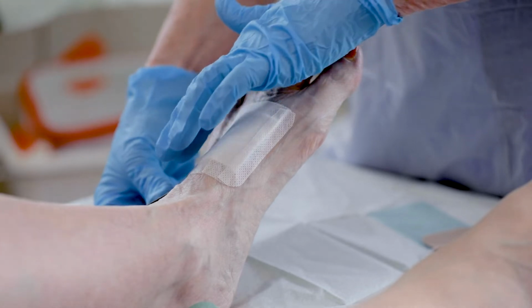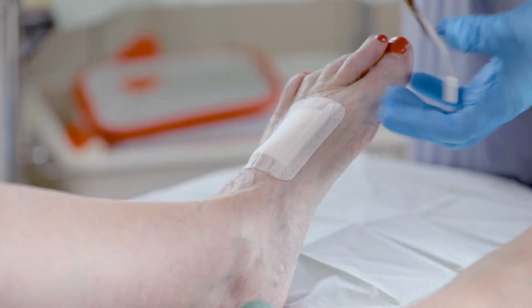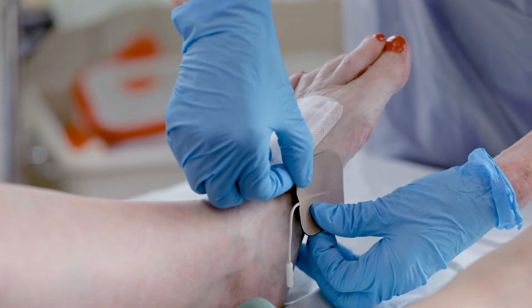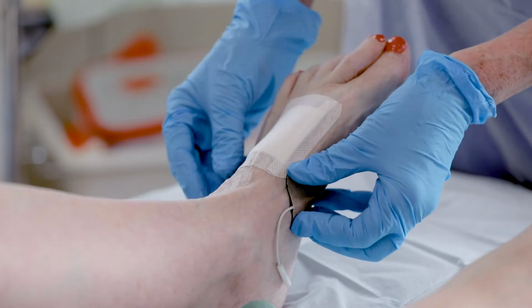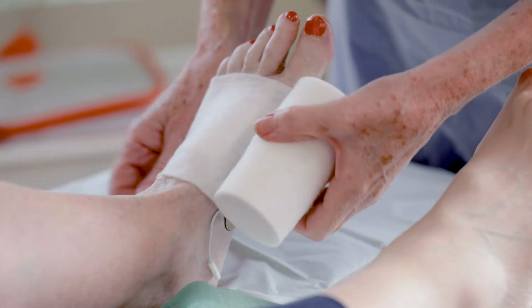Apply the Accel-Heal pads as close as possible to the wound site on healthy skin either side of the wound, but ensure the pads are applied away from the area covered with the primary dressing. You are now ready to apply bandages to the wound site.